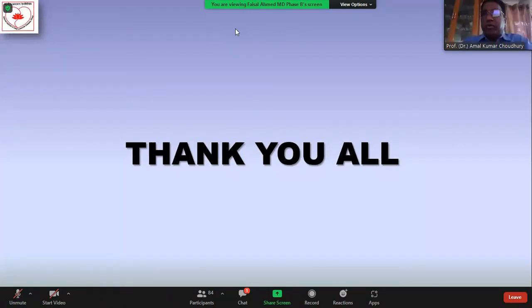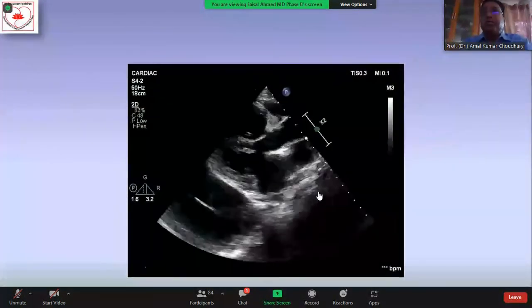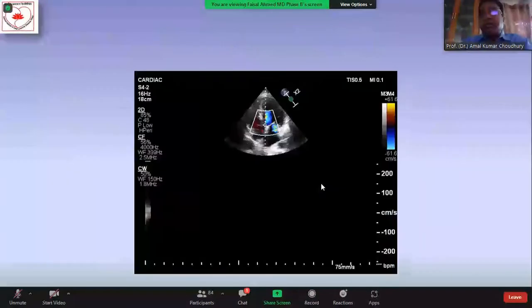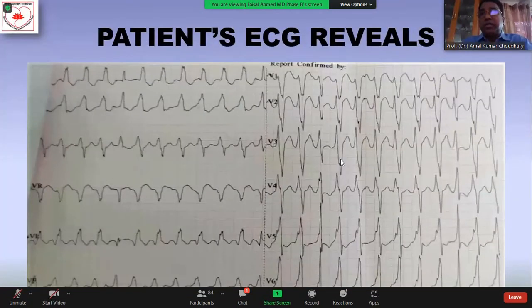You go back to your first ECG and discuss. First, I would like to ask the students, particularly the examiners, to ask questions to the presenter, or other faculty can also supplement the answer of the presenter.